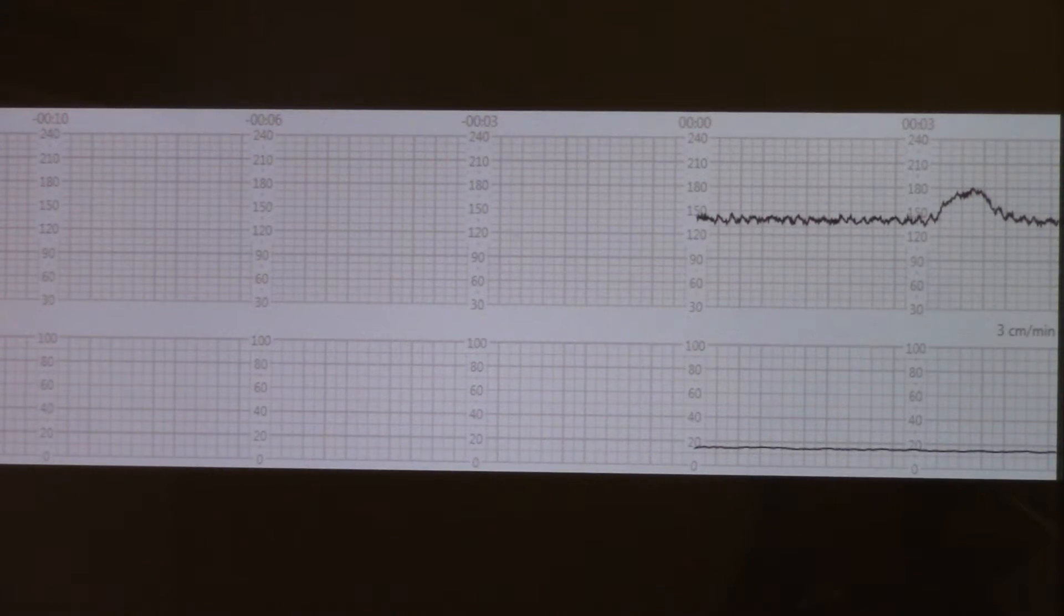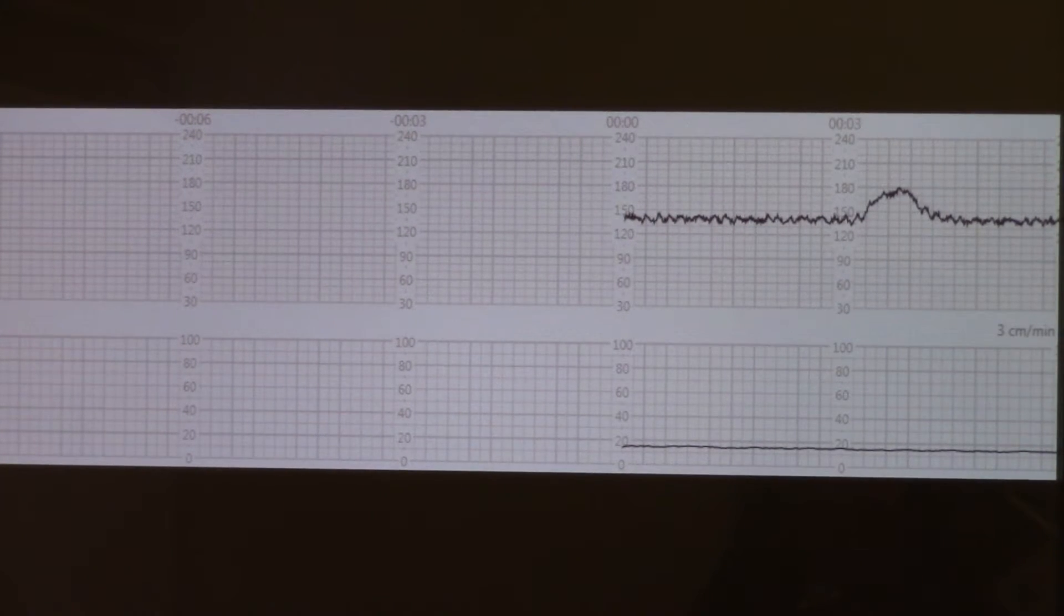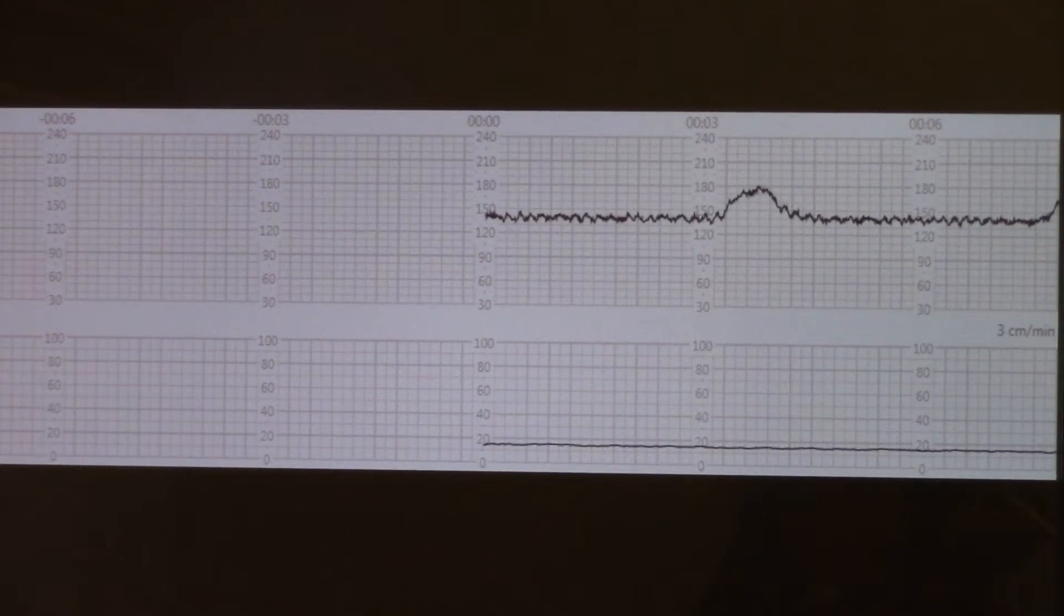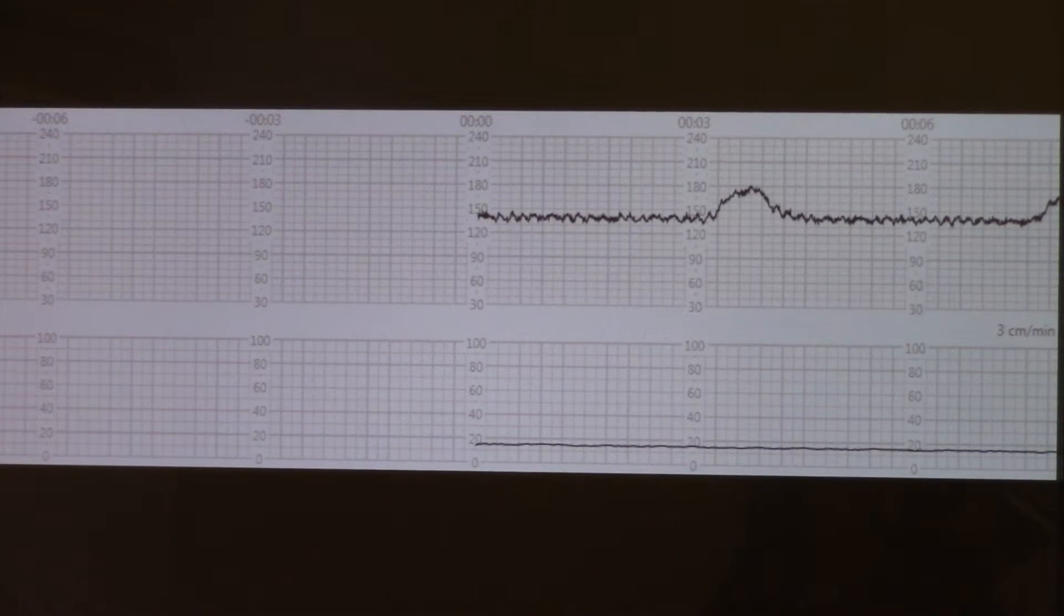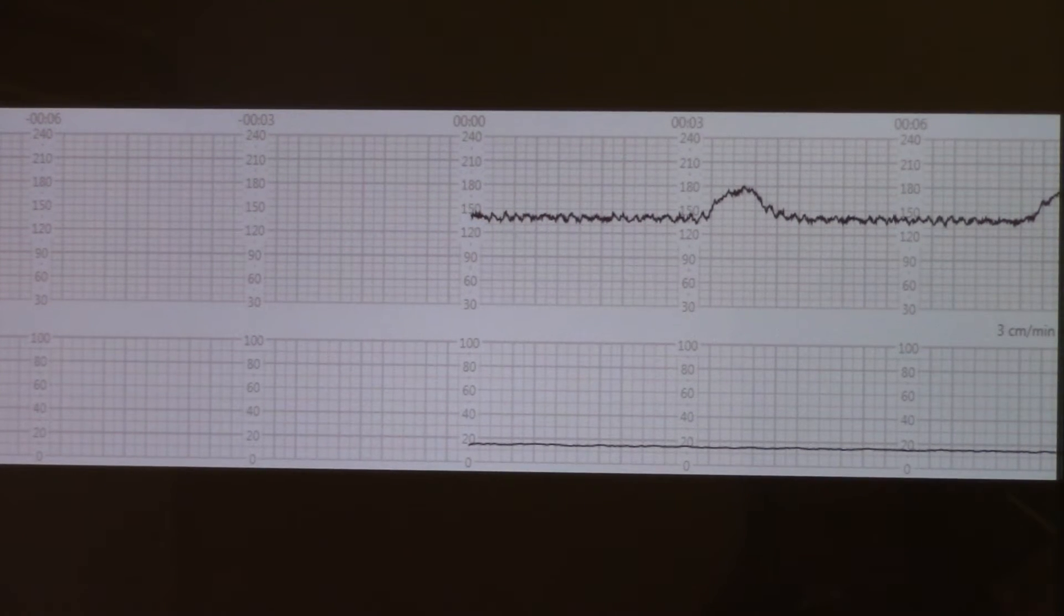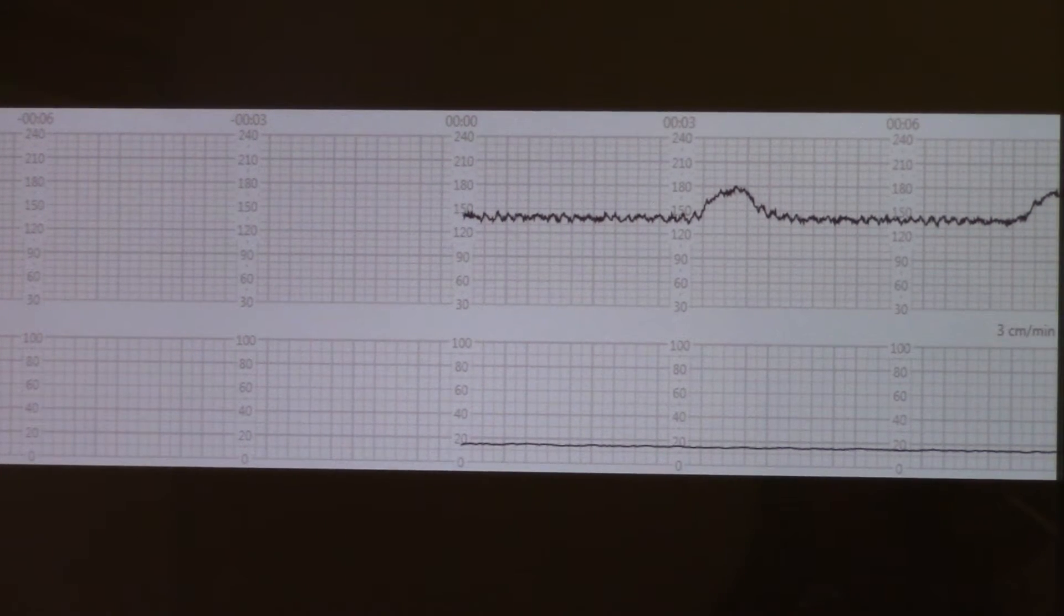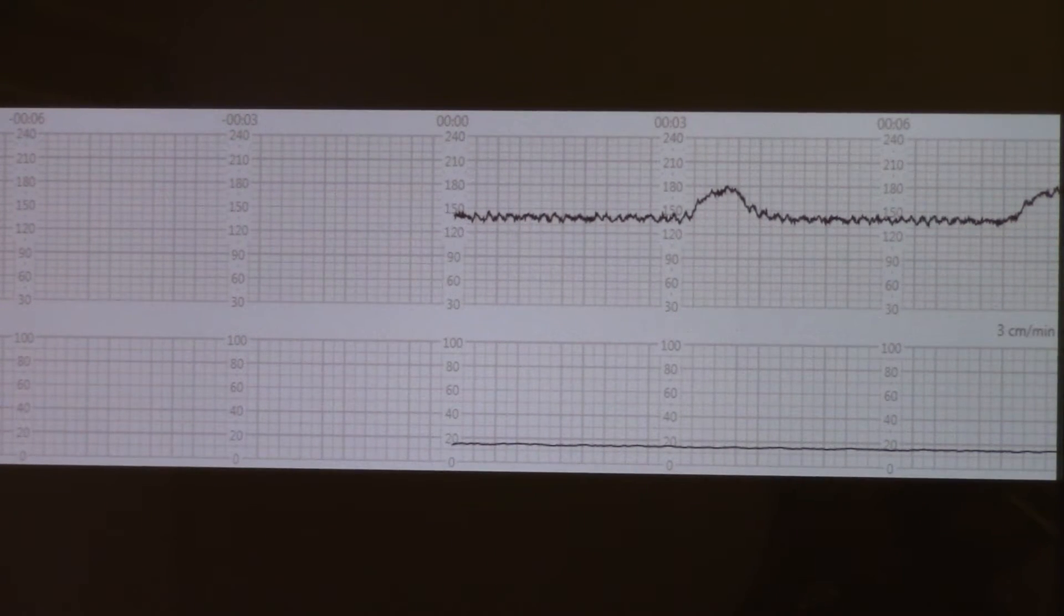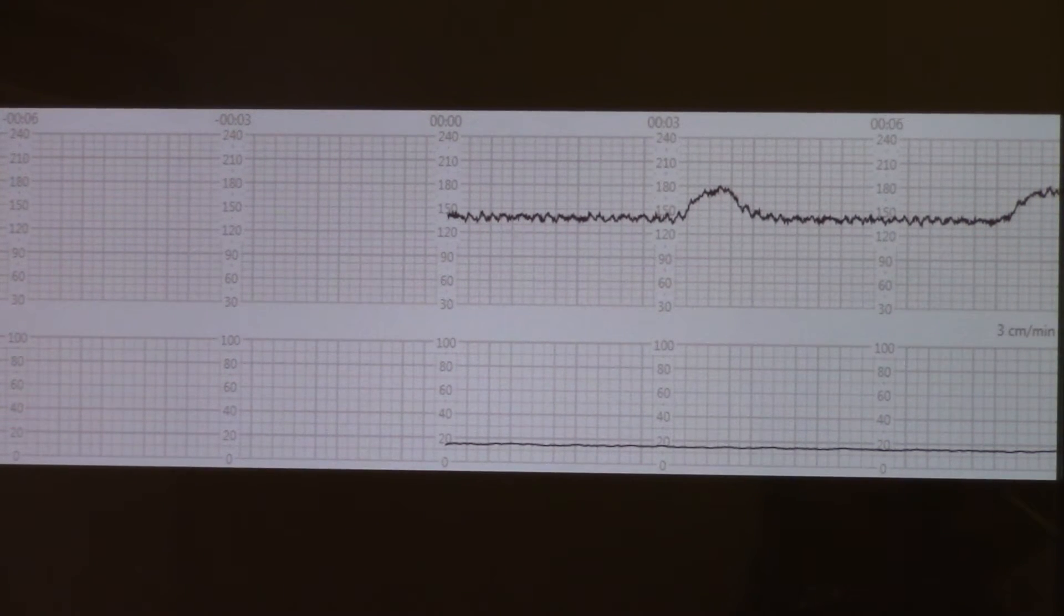If we do, we will have a reactive non-stress test. See no more contractions still. Here we go. And you can hear the heart rate accelerating audibly. You can see the acceleration on the screen. Now it's coming back down. You can hear the change in the heart rate.